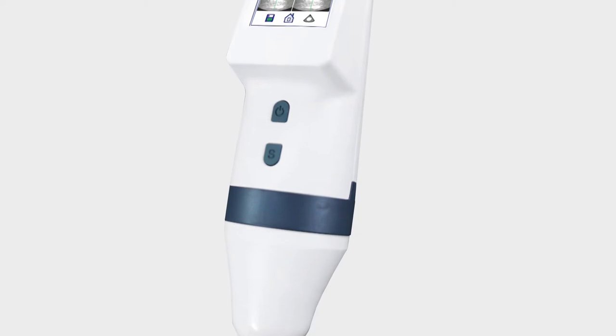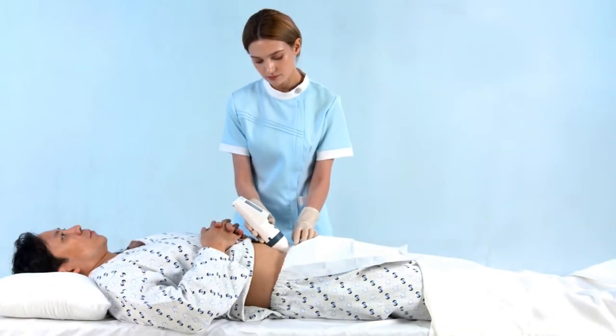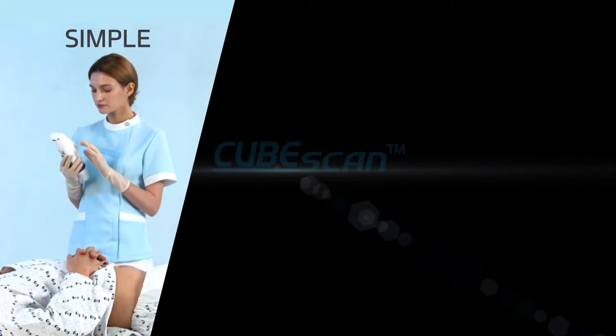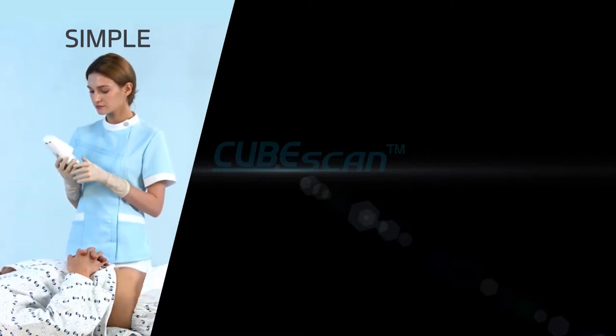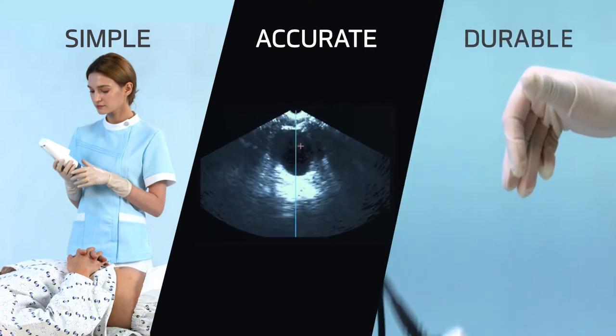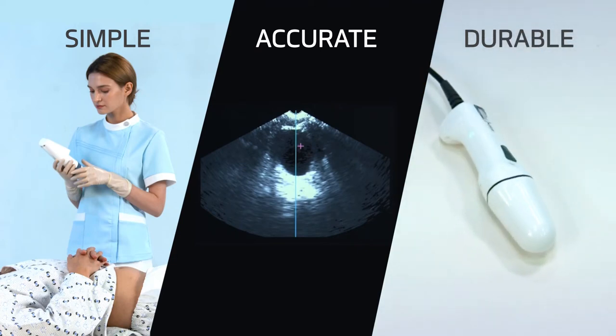Want to make your day easy? Here's the answer. CubeScan Bladder Scanner. Accurate scanning regardless of gender, age, and disease leads to quick and simple workflow. Industry-first live pre-scan imaging and bladder point targeting make it easier than ever to find the bladder.